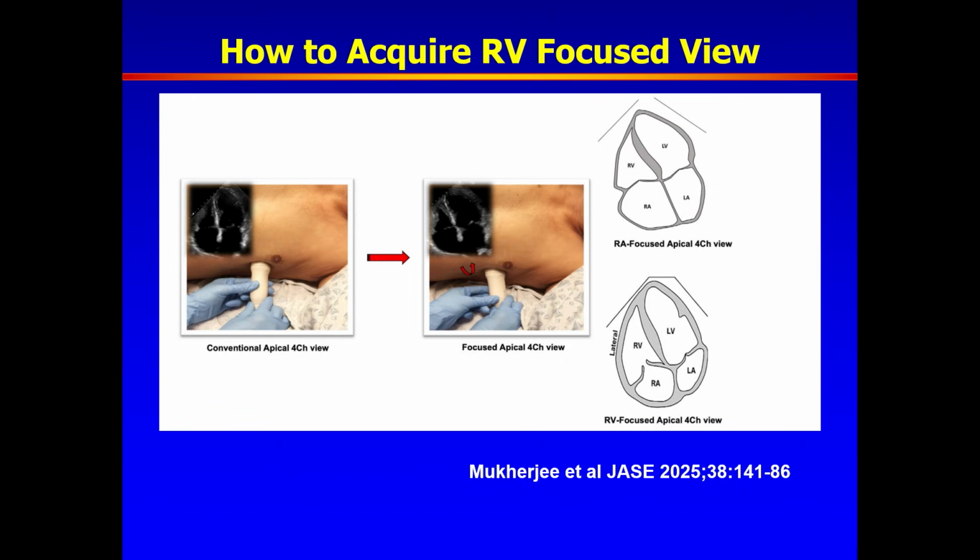As I am rotating, I will see a larger and larger right ventricle. I keep rotating till I get the maximum minor dimension of the right ventricle, taking care not to foreshorten the RV and still show the apex. Frequently, this means you need to do a slight lateral displacement of the probe together with an upward tilt towards the right ventricle. And that's the view that we get.